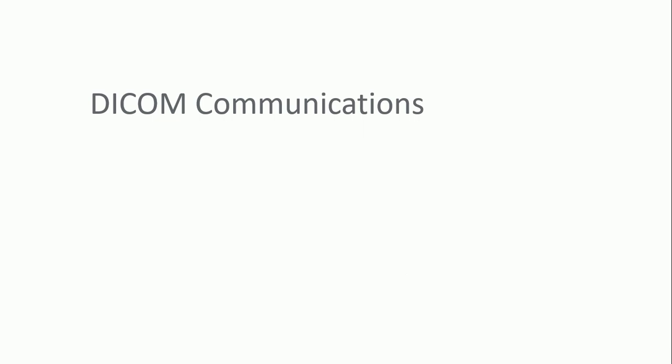This video is going to discuss DICOM Communications, but before we talk about DICOM Communications, I want to talk a little bit about TCP, the Transmission Control Protocol. So TCP/IP is a suite of protocols that we use for network communication. Of course, DICOM relies heavily on TCP/IP. So I think to understand DICOM Communications, we really have to understand the TCP/IP first. So I'm going to talk about that first.